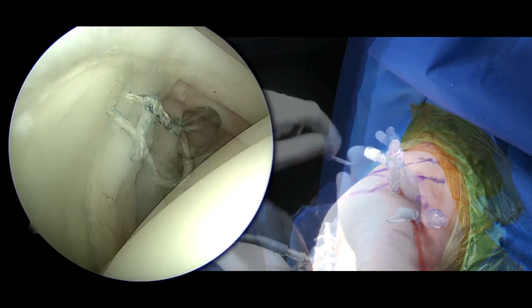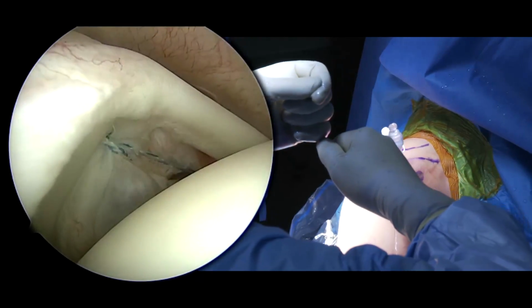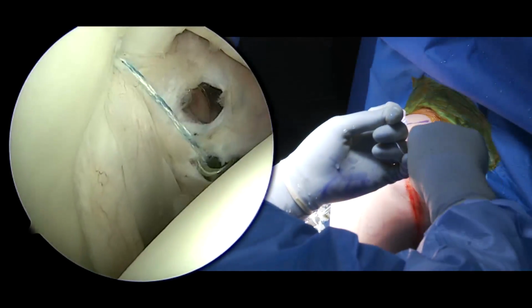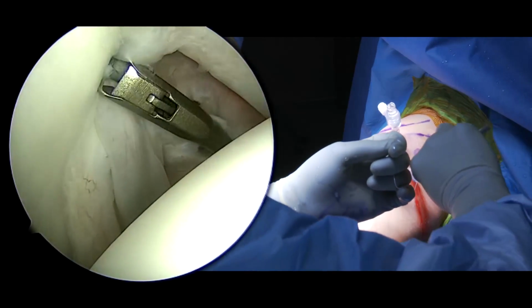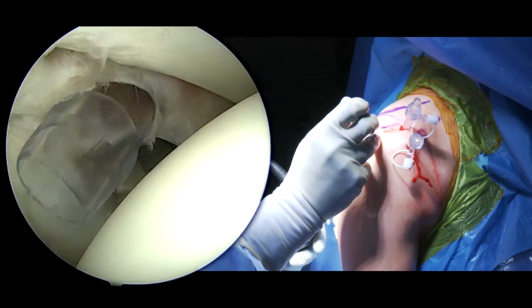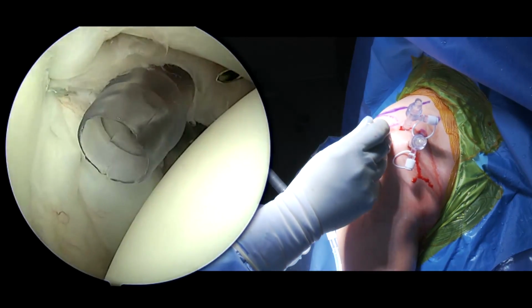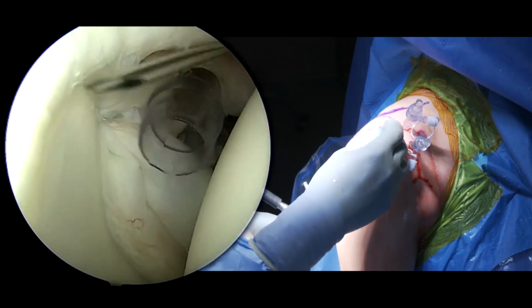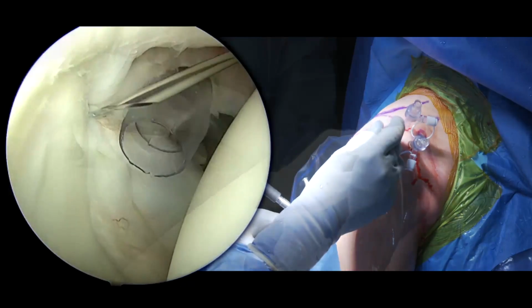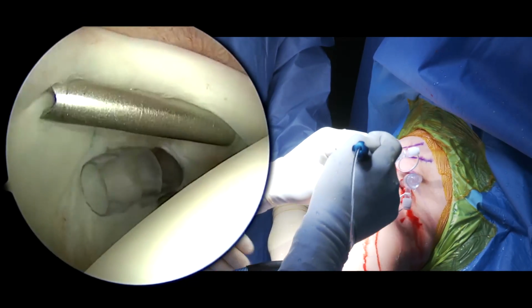As can be seen here, the benefit of this knotless suture device is that it allows for modifiable tension. The anchor is then cut flush with the face of the glenoid. A high cuff-sparing superior lateral rotator interval portal is then established, first evaluating the trajectory of the portal with the utilization of a spinal needle.